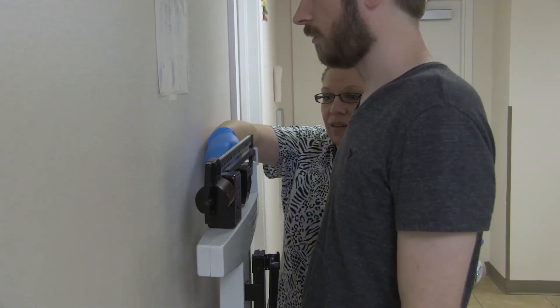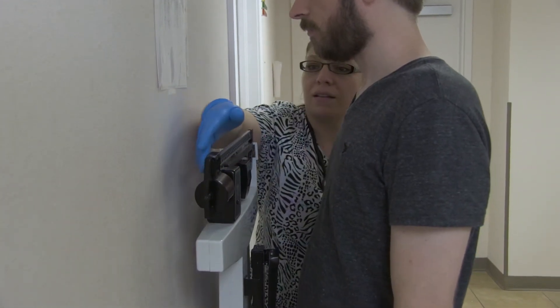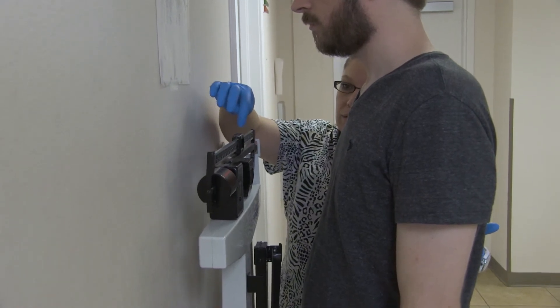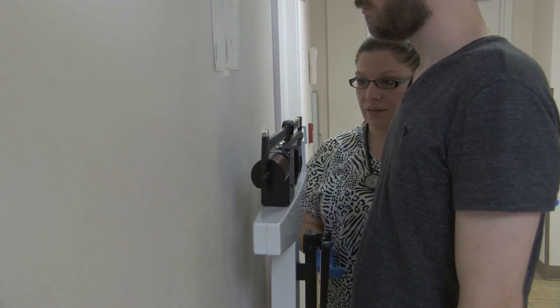For balance beam scales, move the lower weight bar — measured in 50-pound increments — to the estimated weight. Slowly slide the upper bar until the balance beam pointer is centered. Read the weight by adding the upper bar measurement to the lower bar measurement.